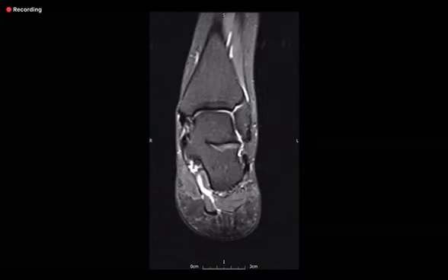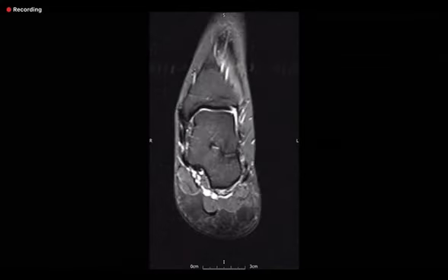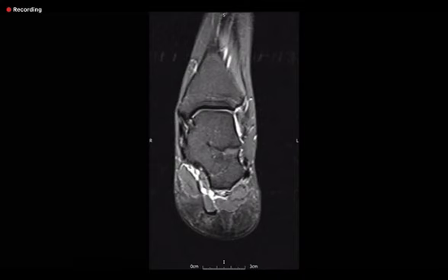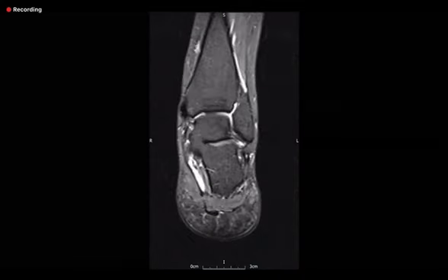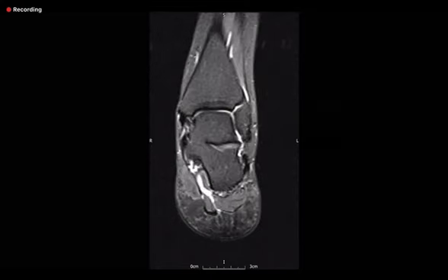Yes, please. What is your finding? So I can see there's fluid at the tendon of the... Where are we here? So this is the... that's the talus, and that is the continuation into the calcaneum. So have you confirmed your diagnosis?